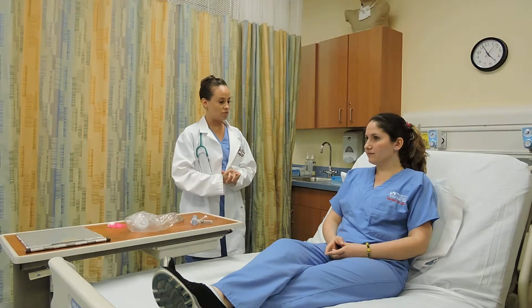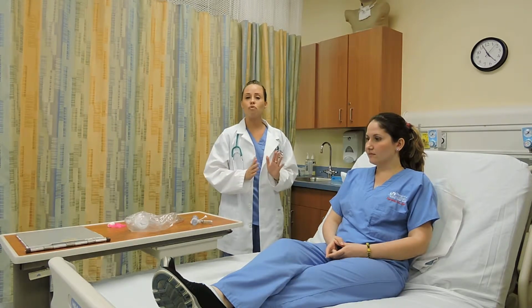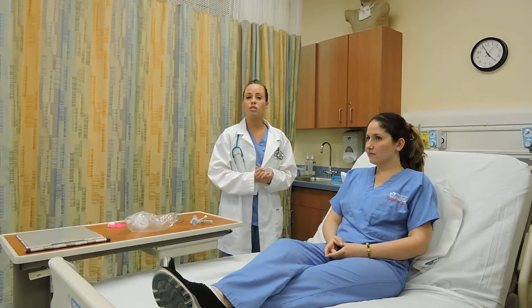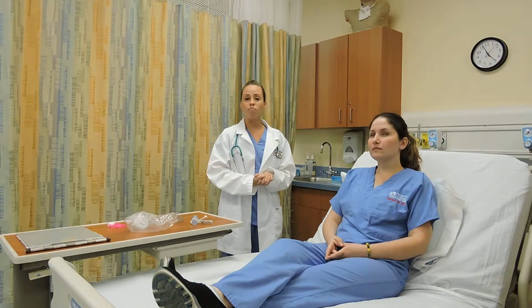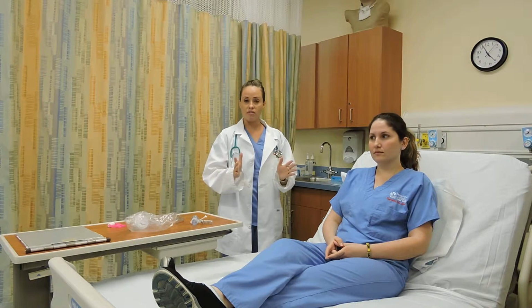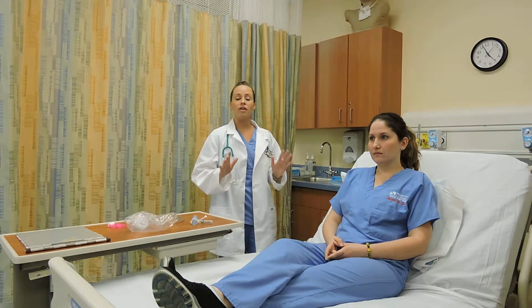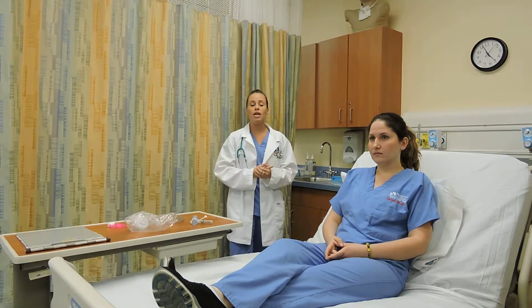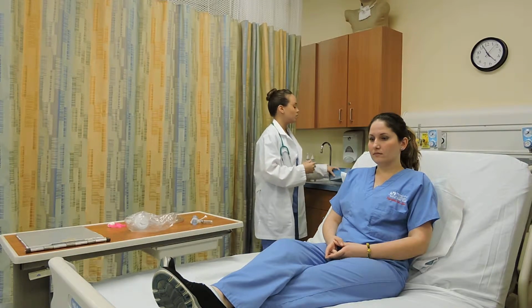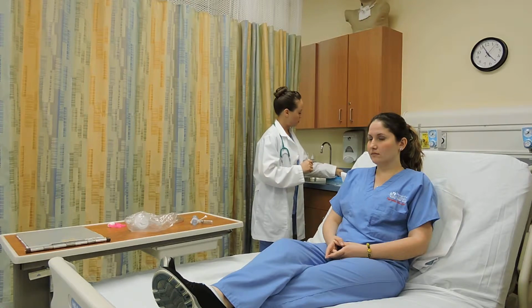Before I attempt to do any patient assessment, I'll make sure to perform hand hygiene by either washing my hands for 15 seconds or utilizing the alcohol-based hand rub, which for these video purposes, I'm only going to verbalize. Once I'm done with hand hygiene, I'm going to proceed to don my appropriate PPE. For this particular procedure, I'm only going to need gloves.